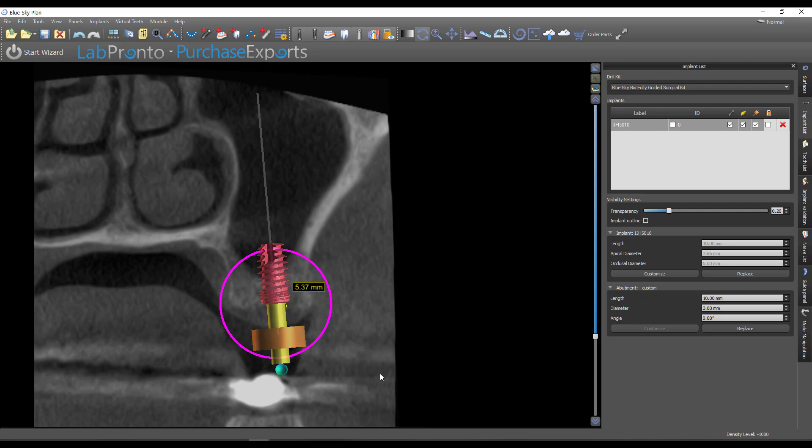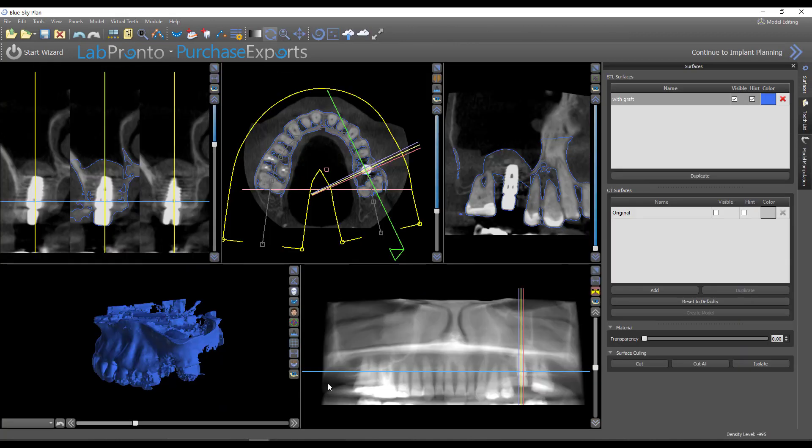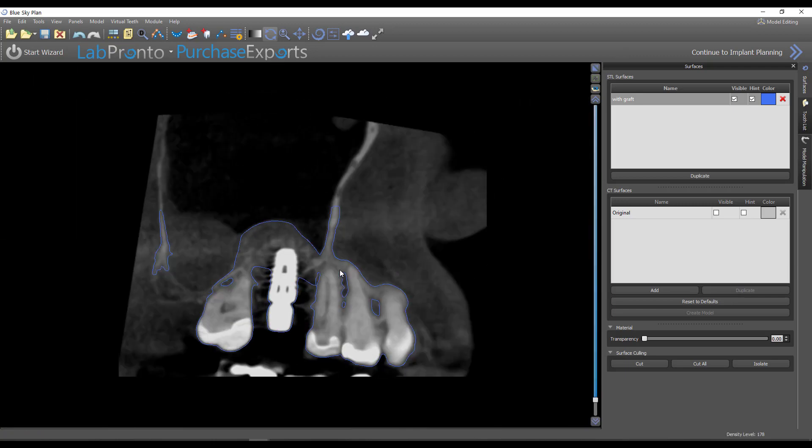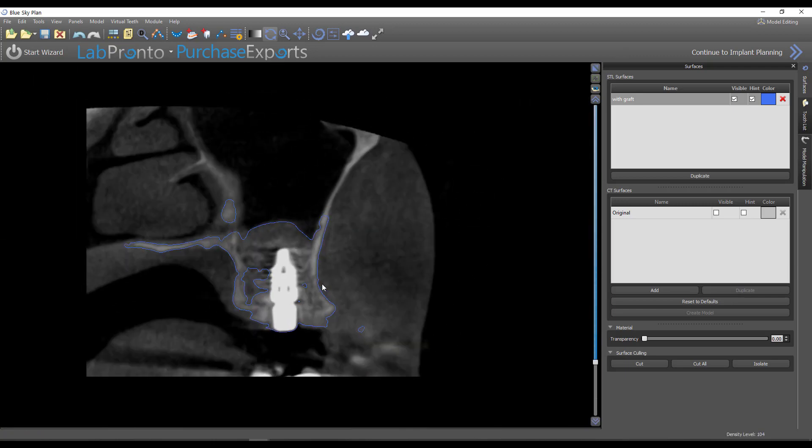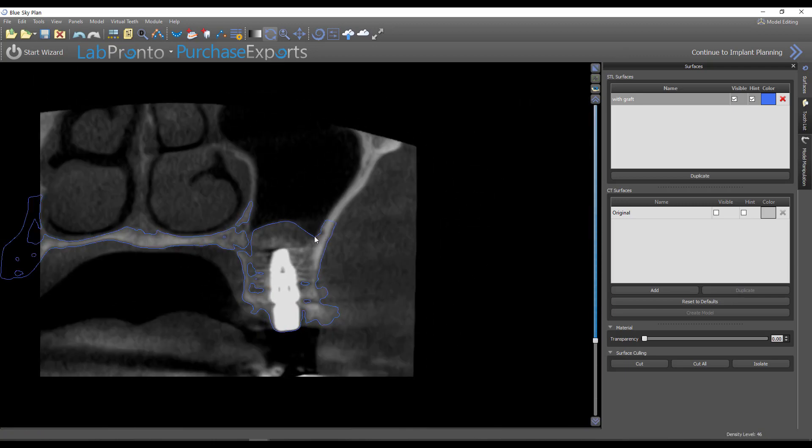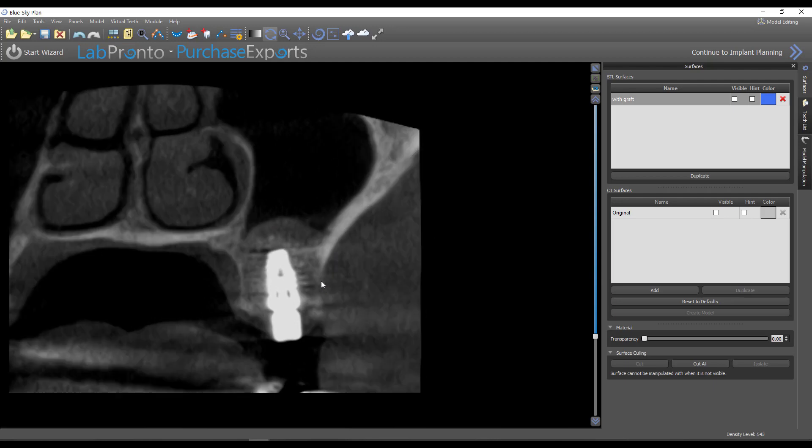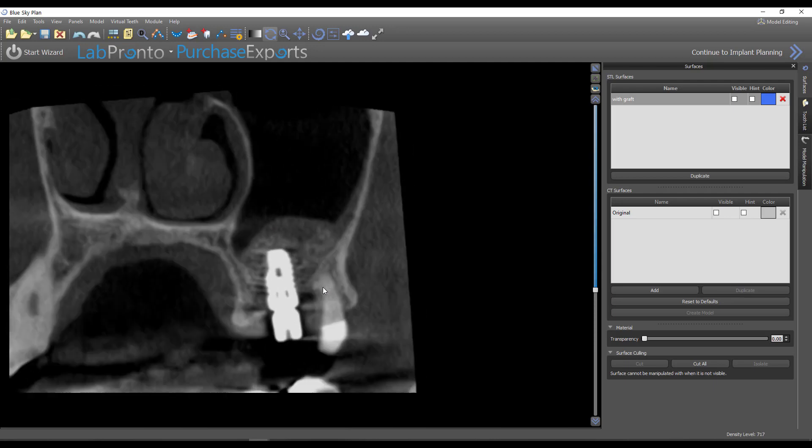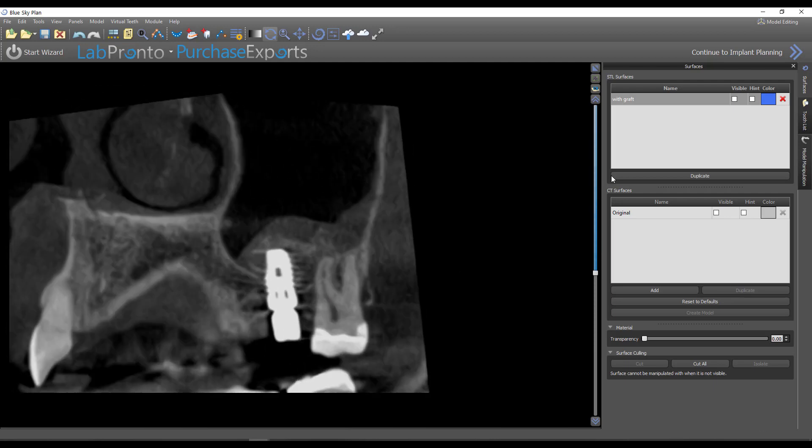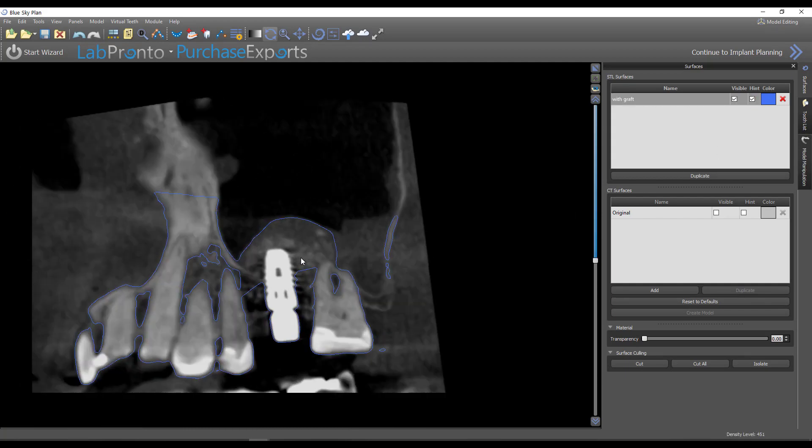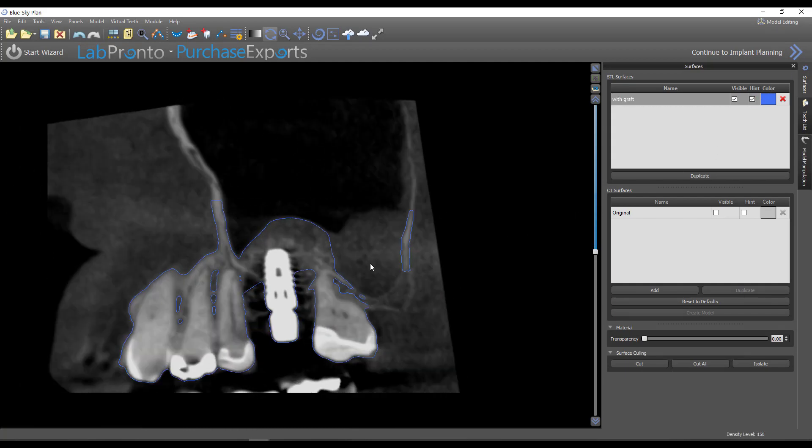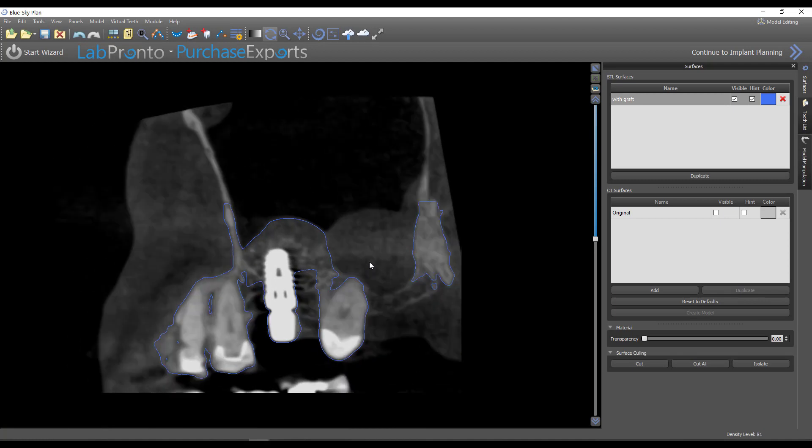Again, a very common scenario. So let me show you the post-operative CT, and you can actually see here that I went ahead and segmented the bone so that you could actually see the full dome there. I mean, just so that you can verify that I'm not lying, I'll turn that off, but you can see the dome of bone that's present here. So a very significant lift, and again, very first time for this person to ever use this kit, and I thought it was an impressive result.